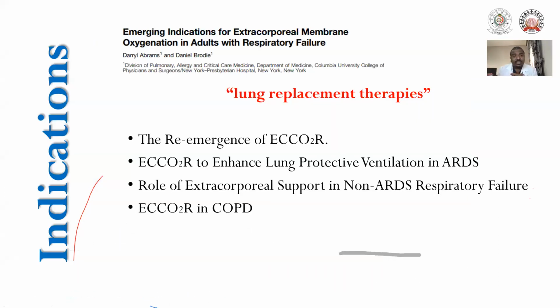There are re-emerging indications, extracorporeal carbon dioxide removal, which is a technique related to ECMO in which lower blood flow rates are used with the primary intention of carbon dioxide removal. Gattinoni and his colleagues referred to this method as lung rest. Maybe you have seen this in the references on ARDS management.